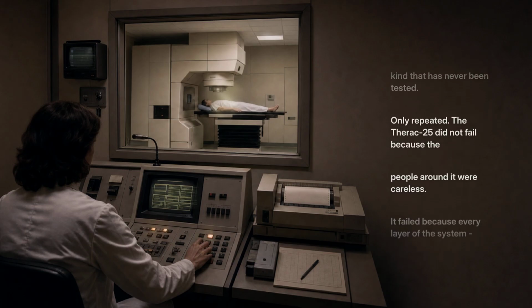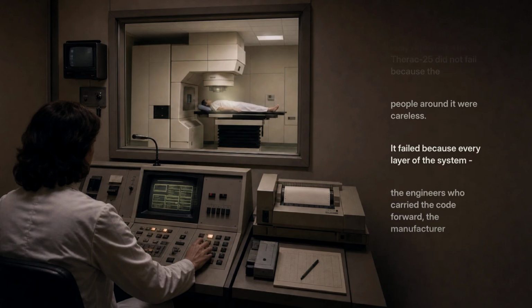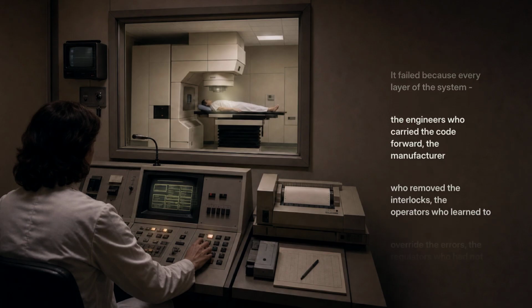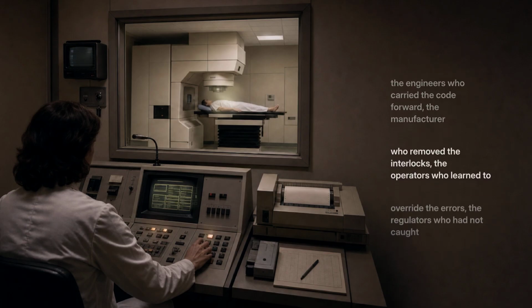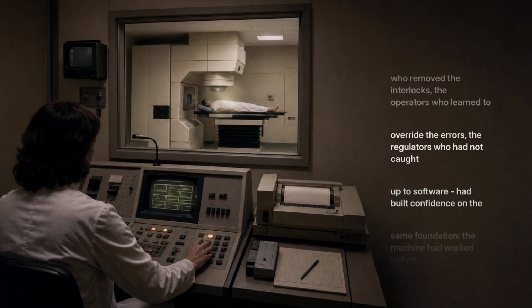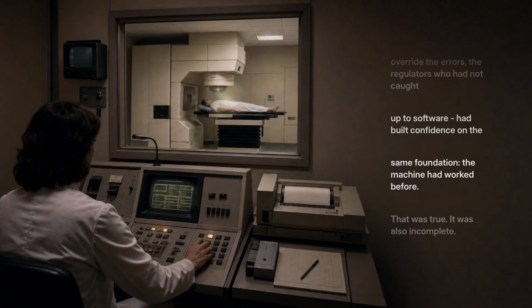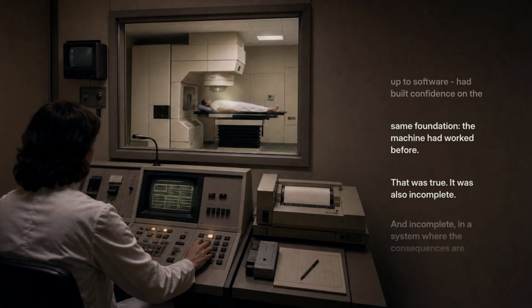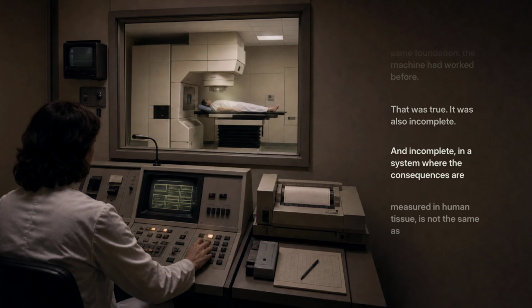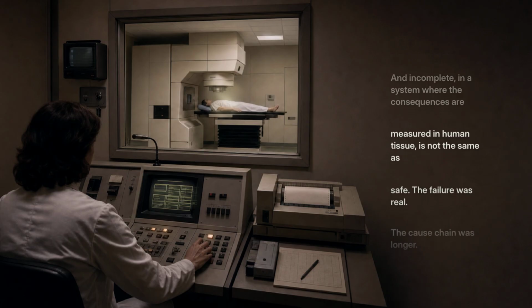The Therac-25 did not fail because the people around it were careless. It failed because every layer of the system, the engineers who carried the code forward, the manufacturer who removed the interlocks, the operators who learned to override the errors, the regulators who had not caught up to software, had built confidence on the same foundation. The machine had worked before. That was true. It was also incomplete. And incomplete, in a system where the consequences are measured in human tissue, is not the same as safe.